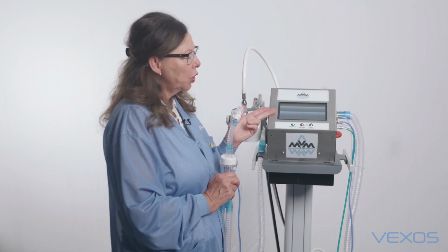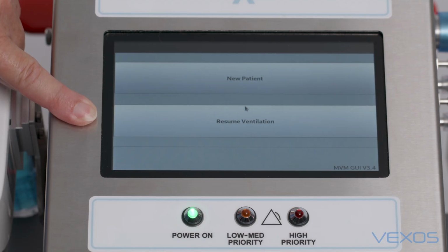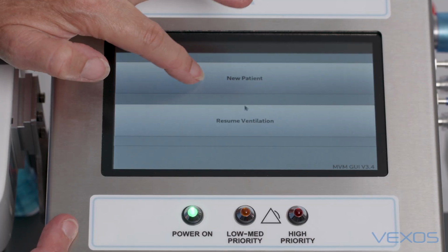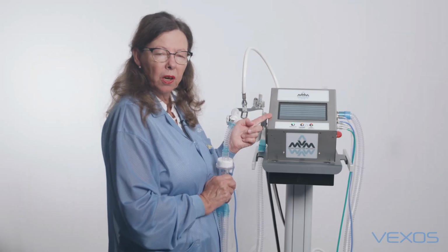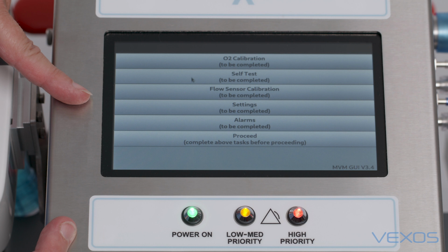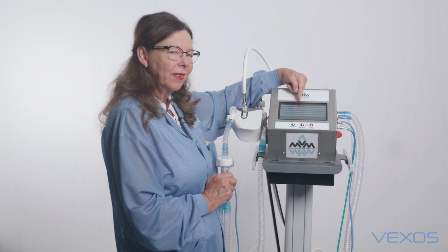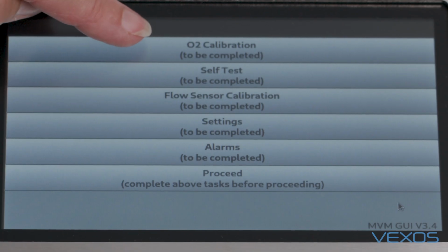Resume ventilation, if the unit has been off for less than 15 minutes, will actually pick up the settings that were previously used. New patient is going to take the operator through all the self-tests that need to be done prior to ventilation. We're going to pick new patient, and the screen indicates all the tests that need to be done prior to ventilation: O2 calibration, self-test, flow sensor calibration, settings, alarms. If you notice, under each of them right now, the text "to be completed" is there. Once the test has been done, that disappears and the text turns green to indicate it has been successfully completed.